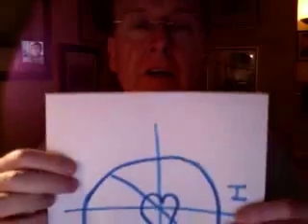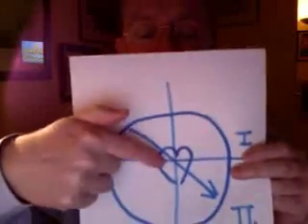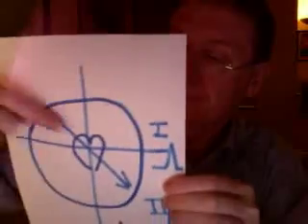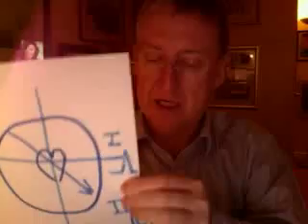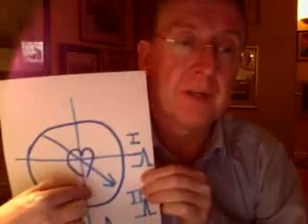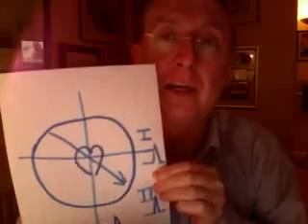But just as a simple way of remembering axis, remember this: the impulse in a heart will start at the top right hand corner and will travel to the area of most muscle, which is the bottom left, the left ventricle, obviously. And if a lead is seeing an impulse coming towards it, like lead 2, this will portray the impulse as a positive deviation. So, if the impulse starts up in the SA node and travels towards the left ventricle, the area of most muscle, lead 2, which looks at that area of the myocardium, will portray the impulse as a positive deflection. It will point upwards.